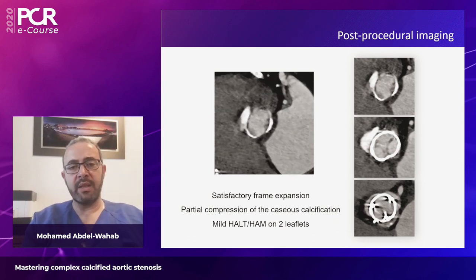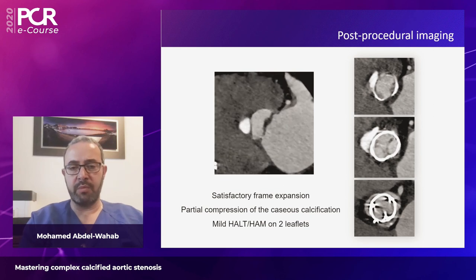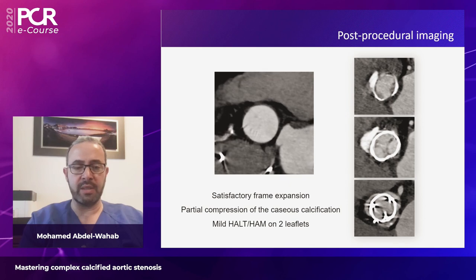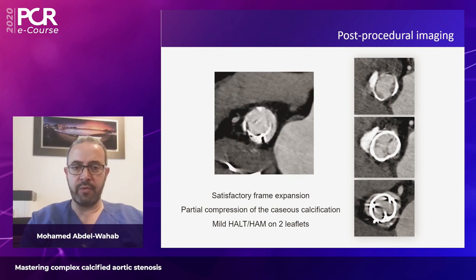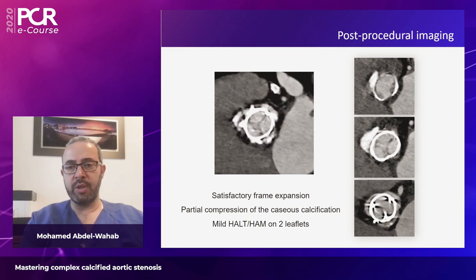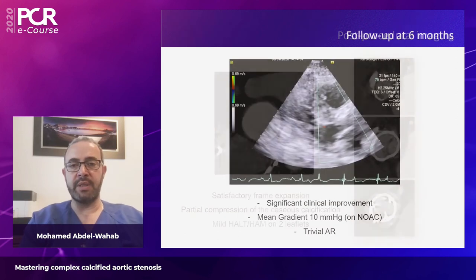This is why we decided, I know this is maybe off-label, but it's a particular decision in this patient that we may want to discuss, to give him anticoagulation for a few months, just to make sure that this hypoattenuation does not increase and that valve function is maintained.